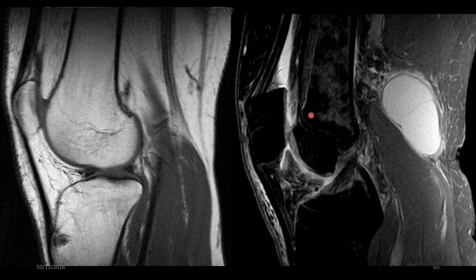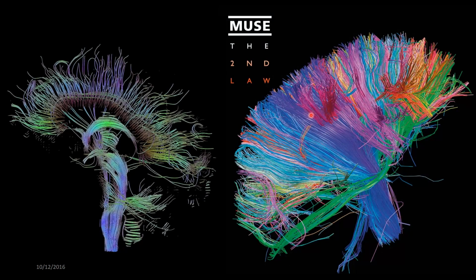And we can do some very funky stuff. Using different principles and field strengths and gradient coils and various other things, we can achieve some absolutely wonderful images. Now, the Muse Second Law album is actually not just a randomly generated picture. This is actually something called MRI tractography. It uses an imaging technique that I won't go into too much detail about because it's headache-inducing. It's called diffusion tensor imaging.